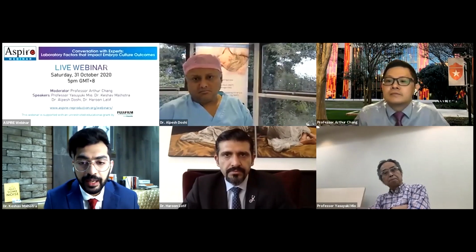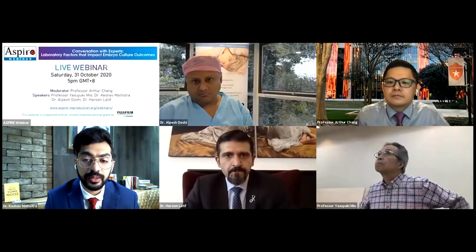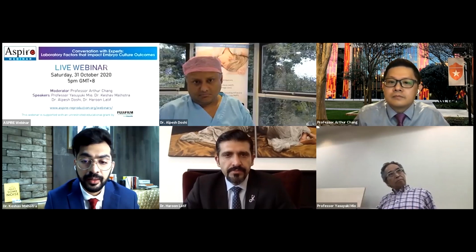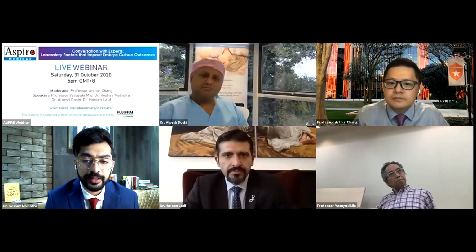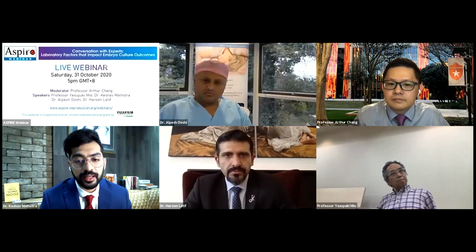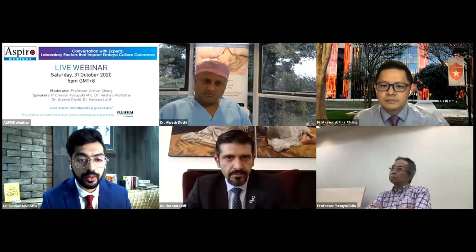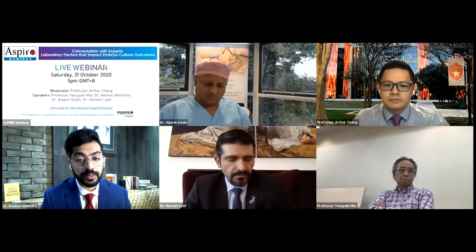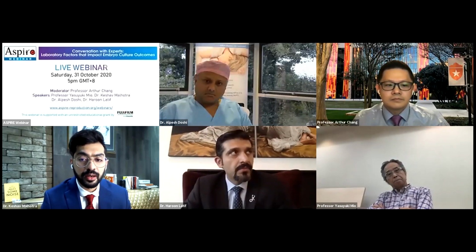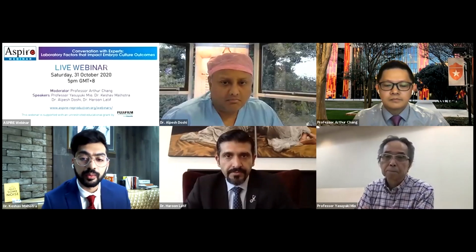But even if you don't have re-expansion and the embryologist has assessed the quality of the cells that is present, and there's no lysis or degeneration, it should not really make much of a difference as far as the results are concerned. There was this paper that I was reading while I was making this presentation, where especially after laser, so if you're doing an artificial collapse, these embryos actually tended to re-expand quicker as compared to a normal blastocyst which has not undergone collapse. So that might also be a strategy for you if you're worried about it. But honestly speaking, I haven't seen any differences when I've transferred a collapsed blastocyst compared to an expanded blastocyst within that 1 hour time period.